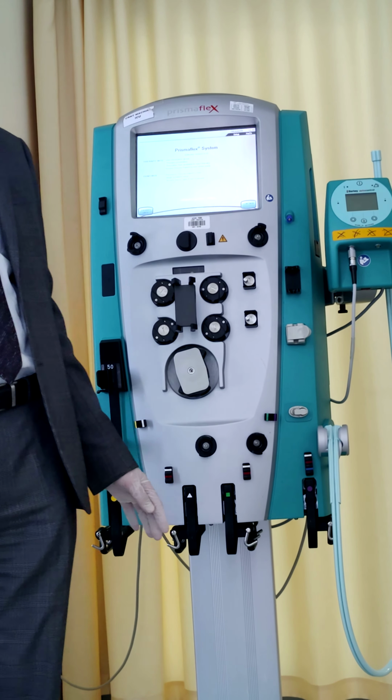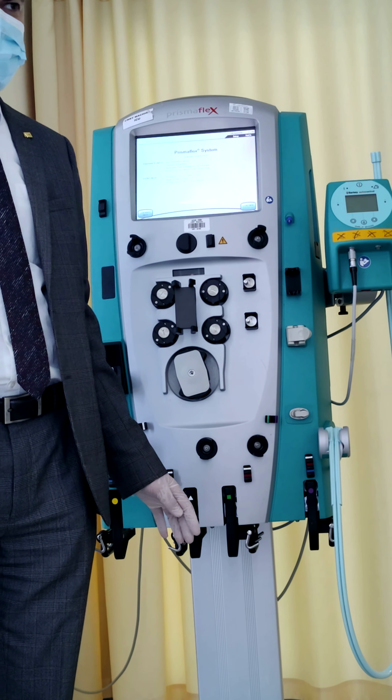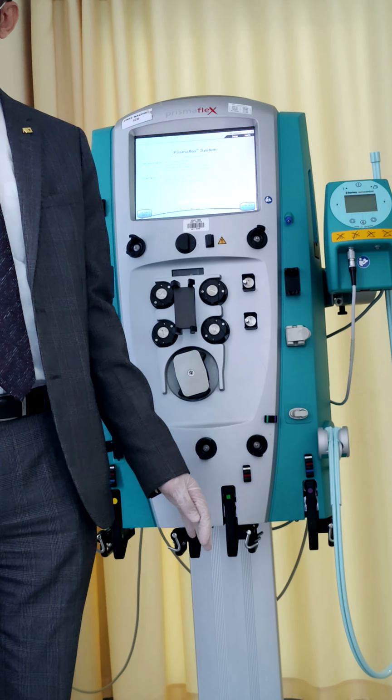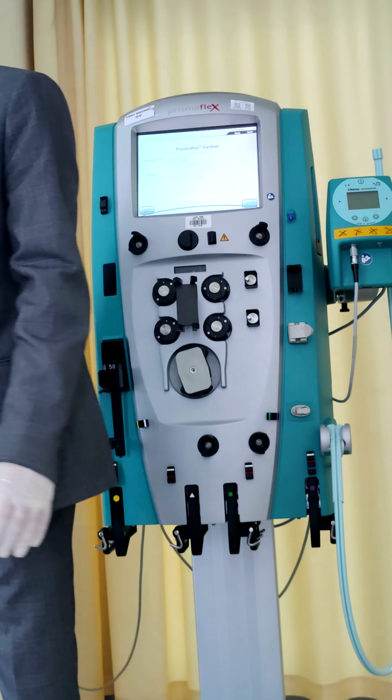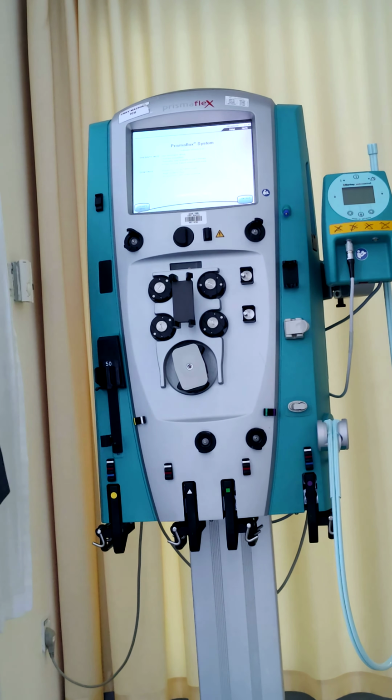I have to inform the machine what is the size of the bag. Definitely you will not find it 2 liter, 3 liter, you will find it like 500 ml or 250 ml, because we are using small bags. We have to add the total volume, right?